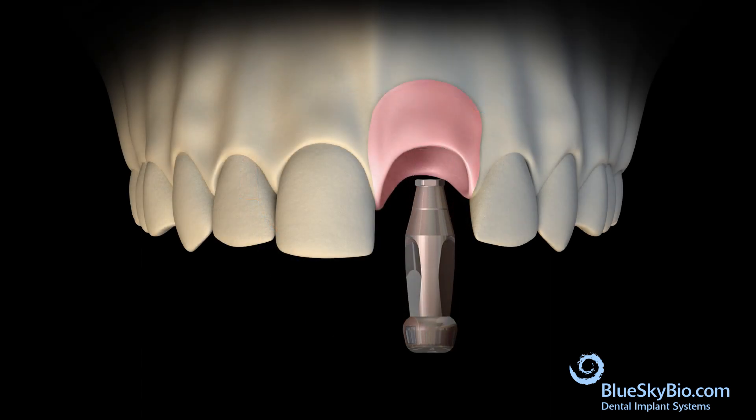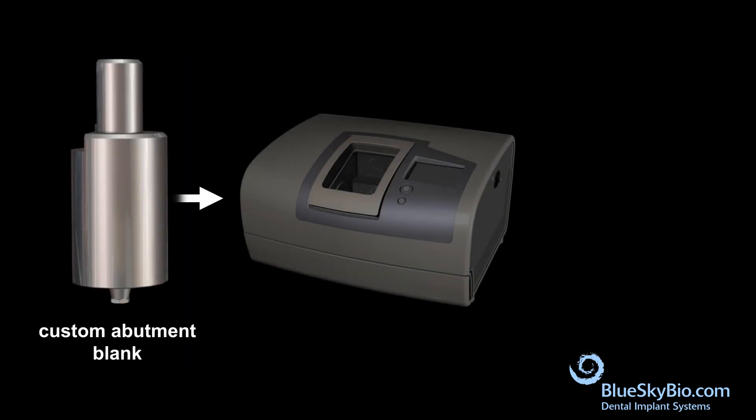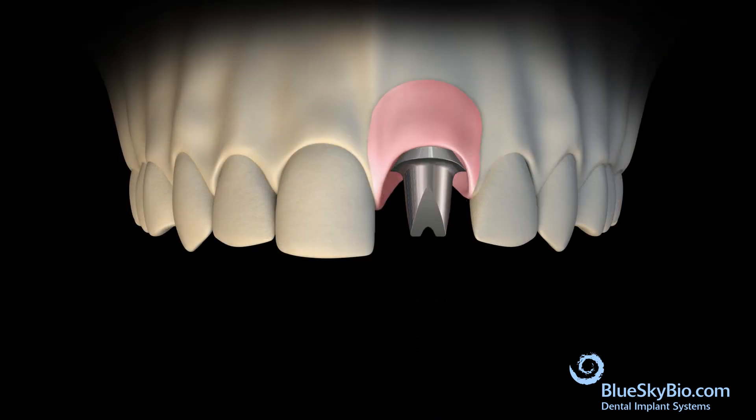Remove the impression transfer from the stone model. Design the abutment in a CAD software. Use a custom abutment blank to mill the final abutment. Place the abutment into the stone model to verify the fit.